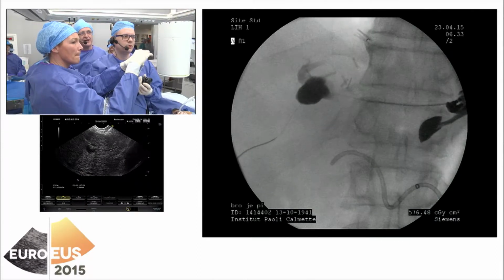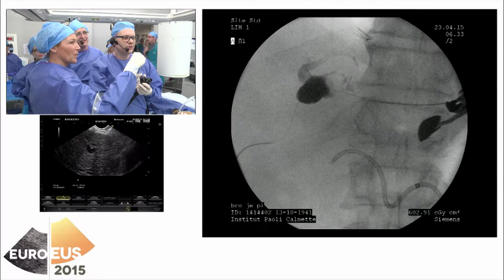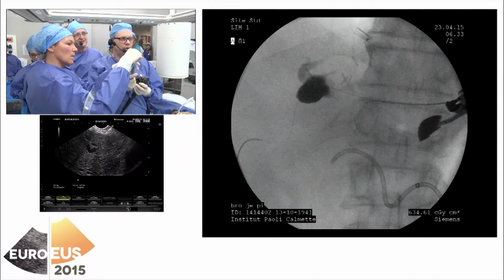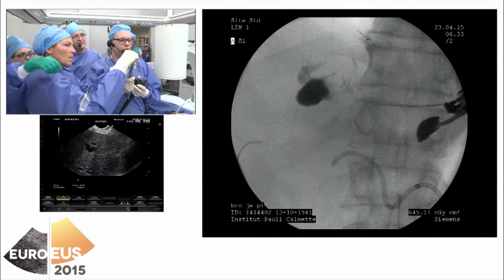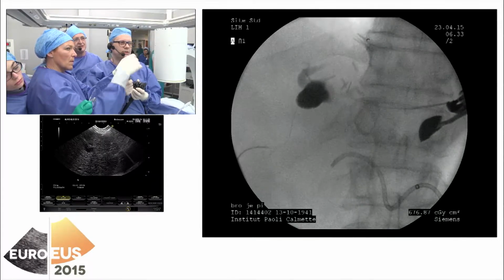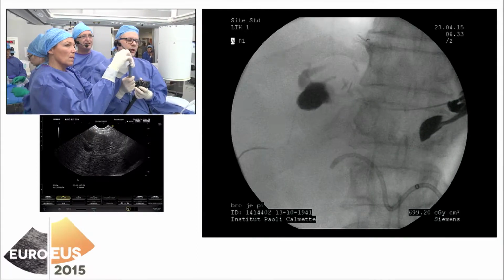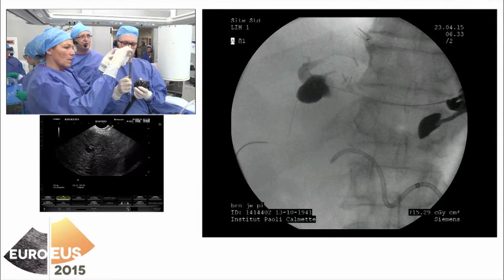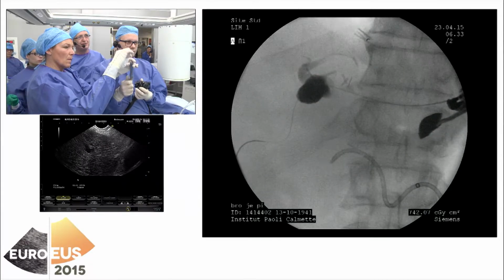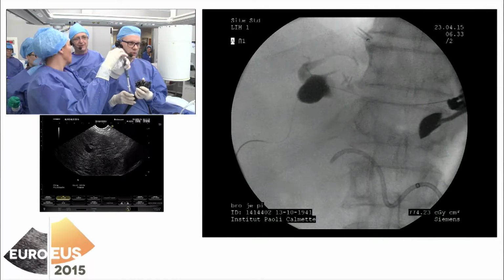That's very nice to be lucky sometimes. Sometimes, yes. But I remove the needle, because it's a 19-gauge needle and we have a risk of stripping the guide wire. So it's not useful to manipulate the guide wire many times. It's an indication to remove the 19-gauge needle. Fluoroscopy. And this is the time when we must use fluoroscopy. I don't know why the guide wire is not going deeper, but we will see that later on when we will be inside with the cholangioscope.